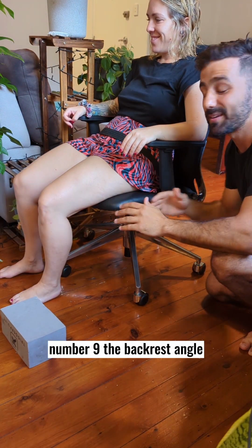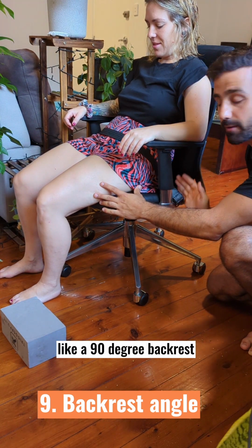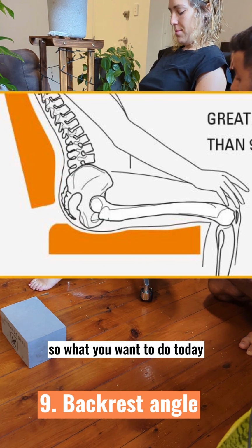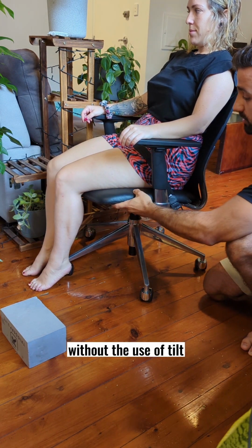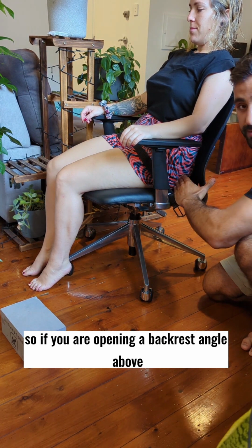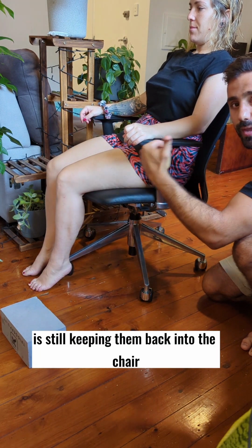Number 9, the backrest angle. If this position is as close as the backrest angle is going to be, if you try to put them into something like a 90-degree backrest, they're only going to slide forward because it can't accommodate them. So what you want to do is accommodate for that hip angle and open up the backrest. Just note that if you open up the backrest angle without the use of tilt, the person's going to have a tendency to slide out. So if you are opening a backrest angle above, say, 100 degrees, you're going to want to consider tilt or rake to make sure gravity is still keeping them back into the chair.